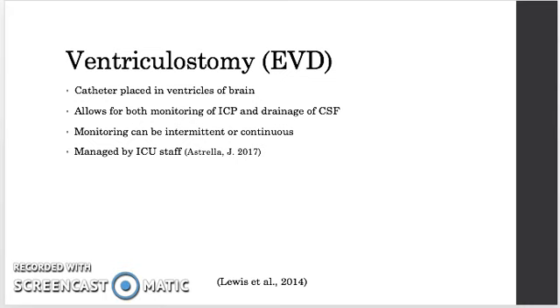When drainage is called for being intermittent, it's really important that the nursing staff have a good understanding of what this means because it's basically autonomous for the nursing staff. So a 3-way stopcock is open for brief periods of time, usually between 30 and 120 seconds, until the pressure is below the patient's upper level parameters, usually less than 15 millimeters mercury.